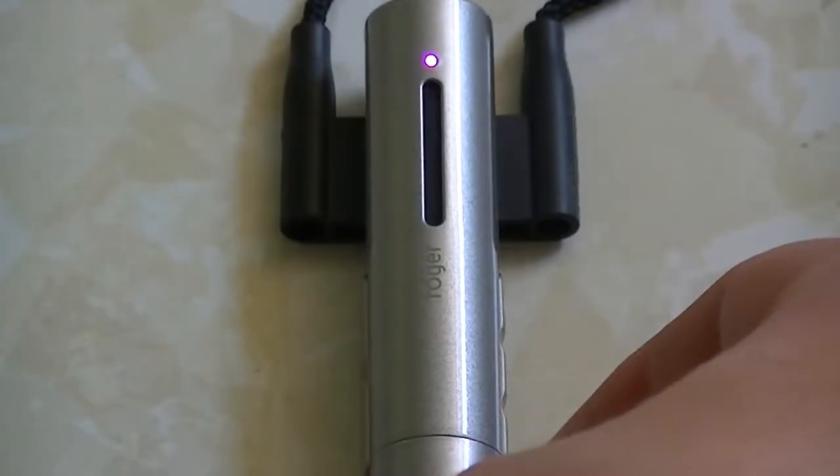Automatic mode is really easy to use, and you could probably get away with using it all the time. The only time I manually switch modes is if I want to use omnidirectional while holding it and don't want to set it down, or if it's on the projector and it's hanging too loud. If it's on the projector and it's too loud, I'll put it on the opposite side of the speaker and switch to the quietest mode — usually the third mode, lanyard mode.